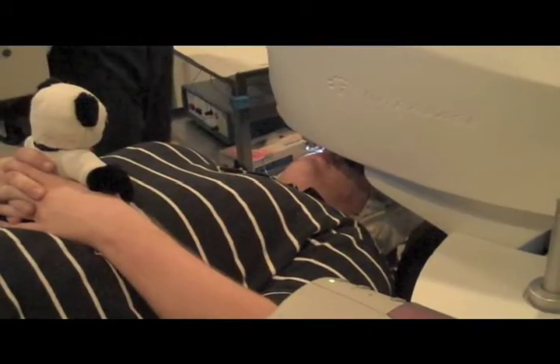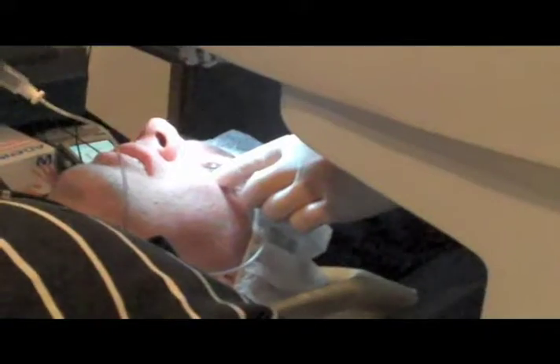totally normal. All I had to do was lay back, relax, and let the doctor create that perforation around the colored part of my eye. The suction was on there because the laser can't cut around a curve, and your eyeball is obviously spherical in shape, so it created a suction for a flat point so the laser could create that perfect little perforation. And after he did the right eye, he moved over to the left eye and did the same thing.